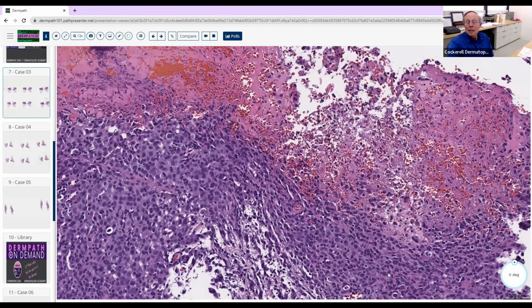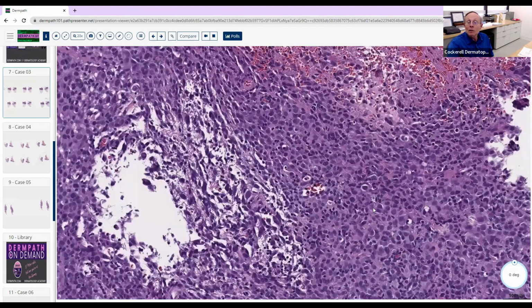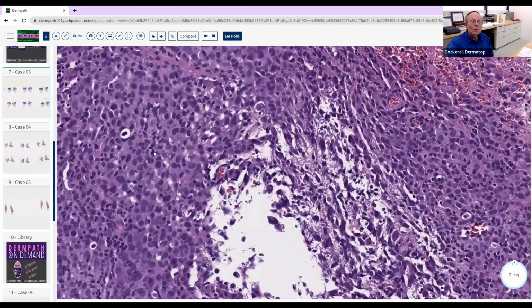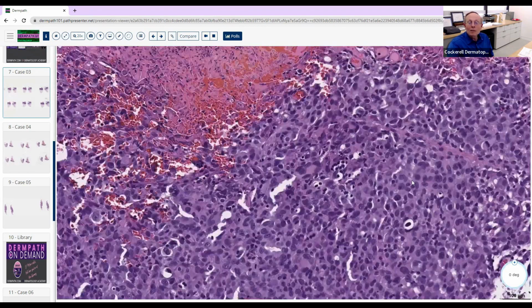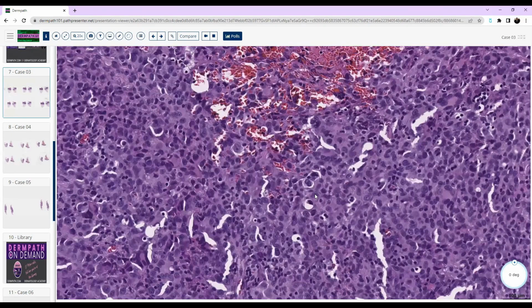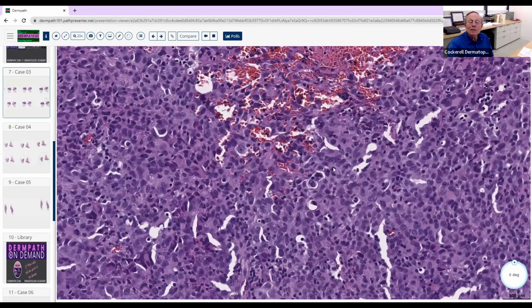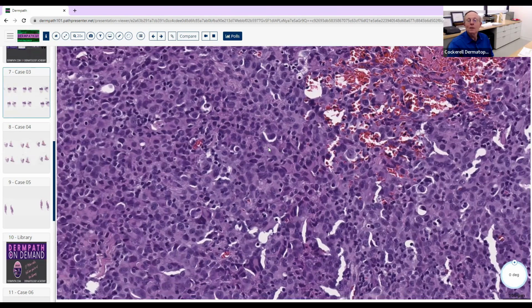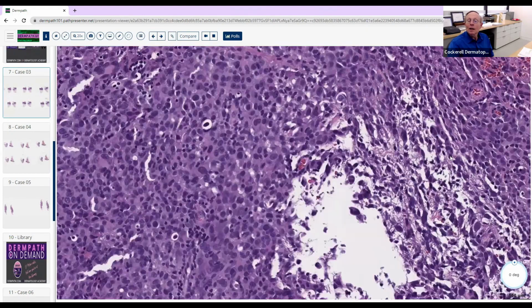Right. And as we look at higher magnification here, can you see that these cells, they don't look totally normal, do they? I mean, you got some that are, that one's dying. Right. Got some that's in mitosis, that's in mitosis. So rather than histiocytes, is it possible this could be something simulating histiocytes? Right. I think so. Good, good. And let's look at another area here.